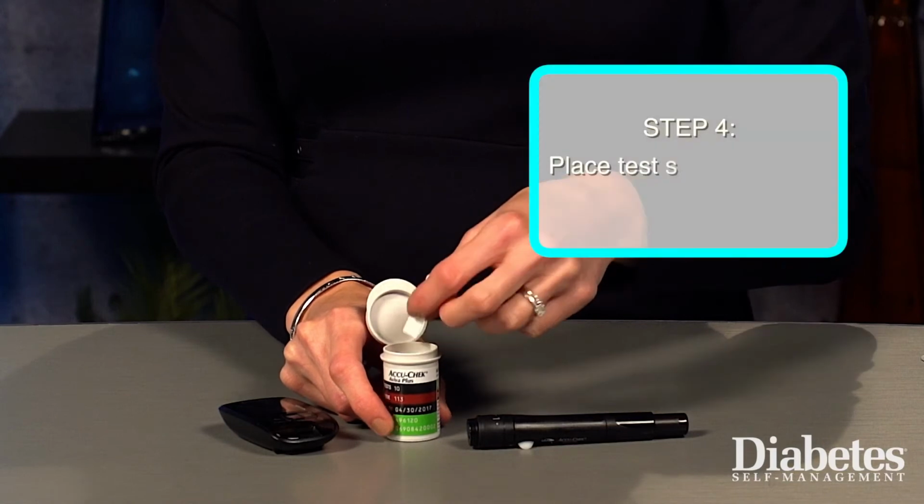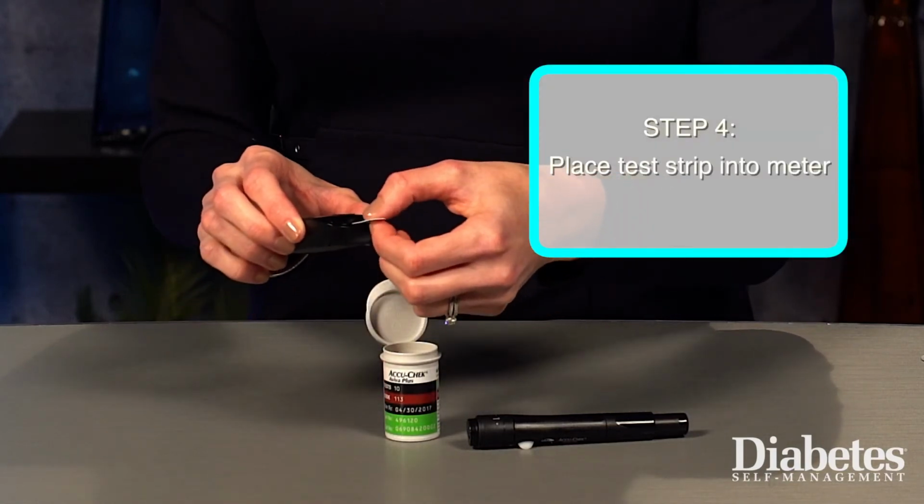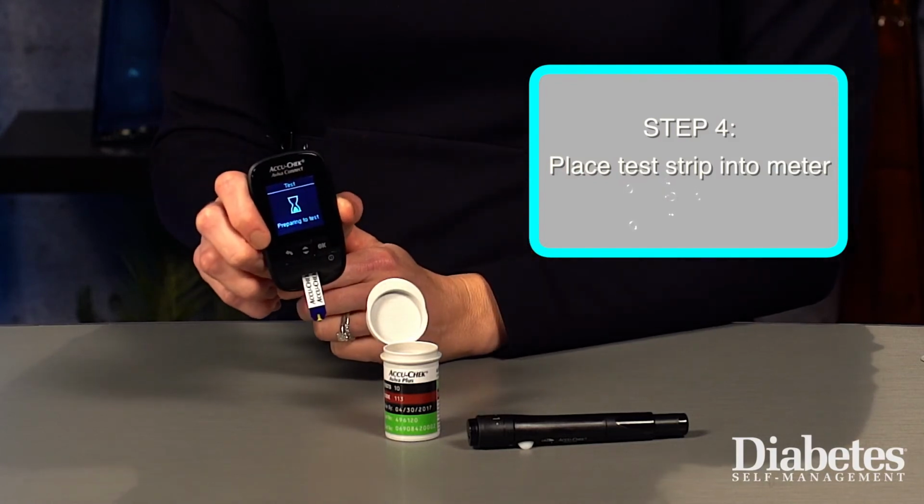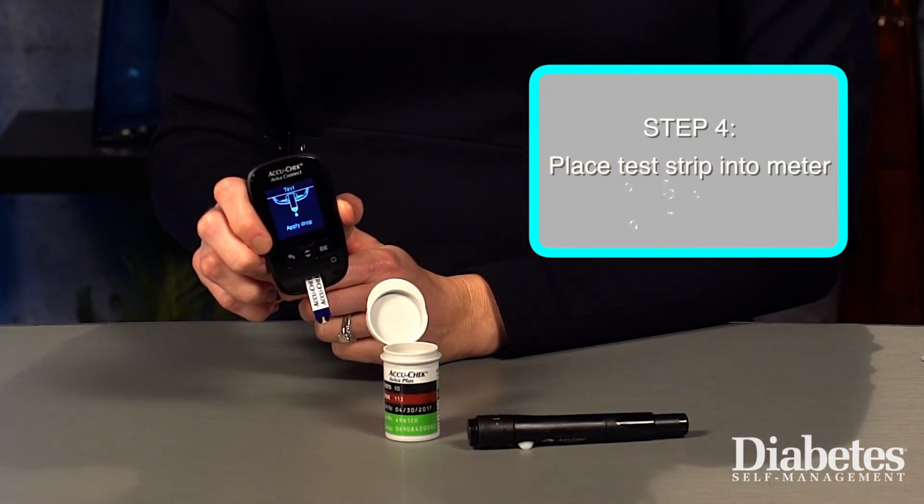Once your lancet device is loaded and ready to go, place 1 test strip into your meter. Usually inserting the test strip into your meter will turn the meter on. You'll want to wait until you see a display sign that the meter is ready to collect a blood sample.